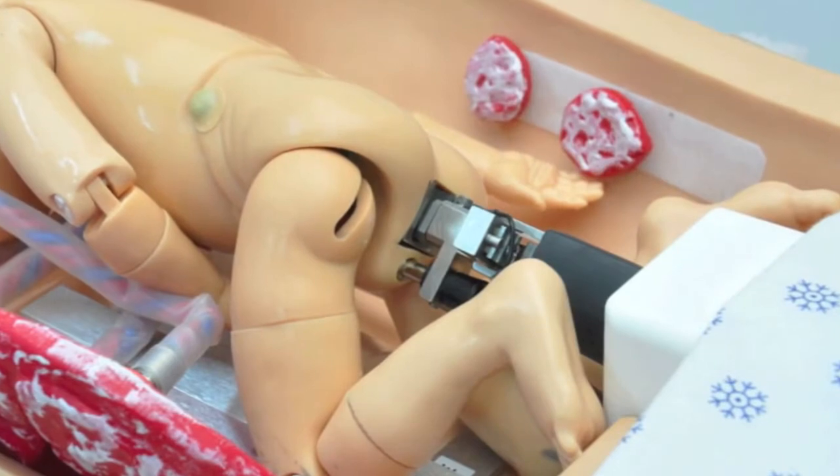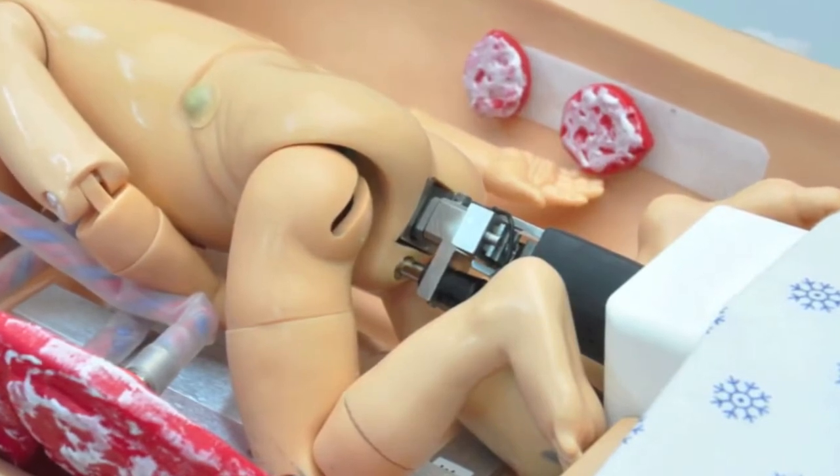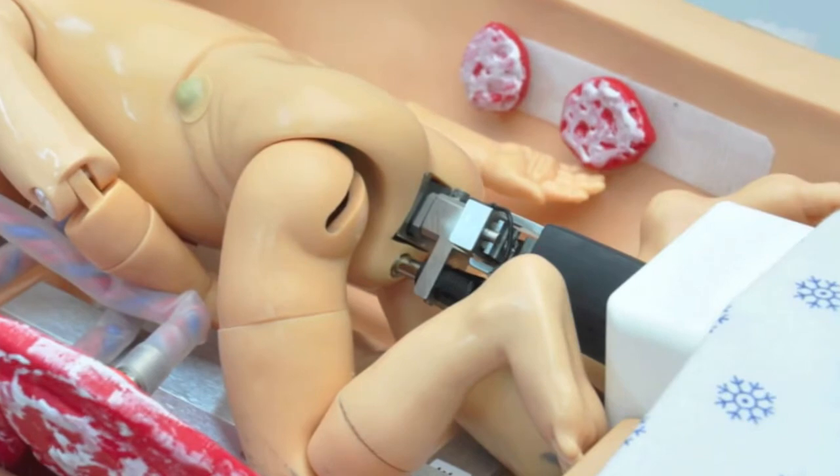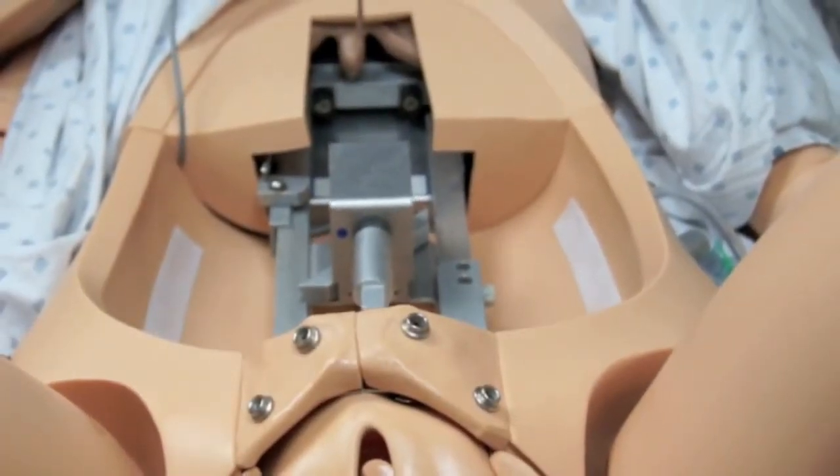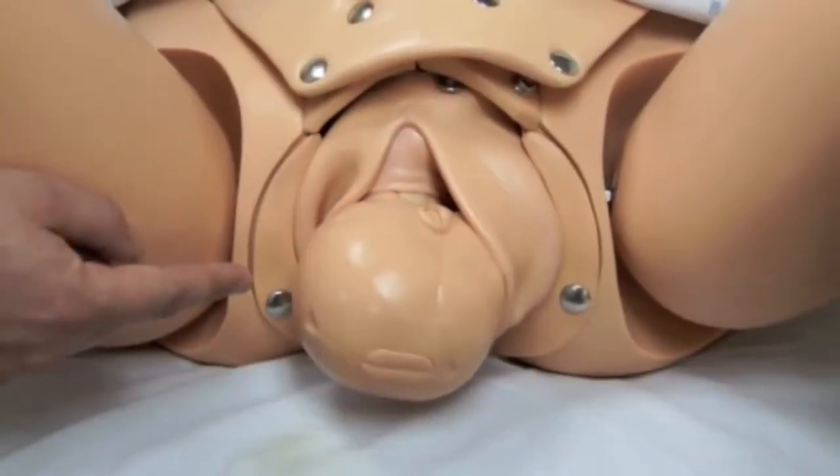The delivery mechanism provides deliveries as short as 1 minute and up to 30 minutes. It has fetal cardinal movements, including internal rotation, translation, and external rotation.